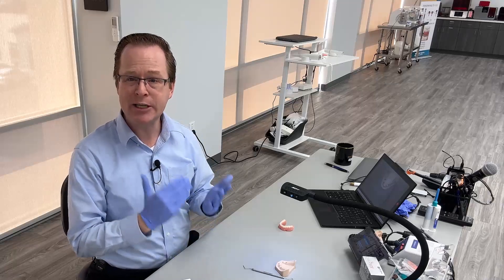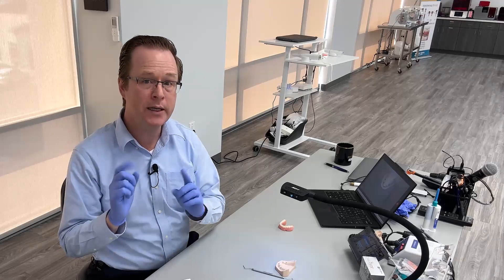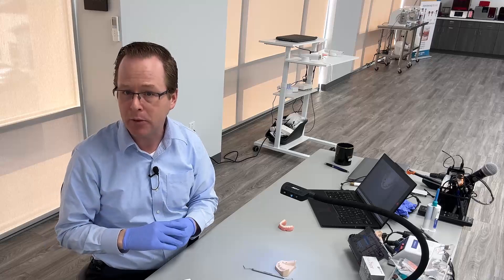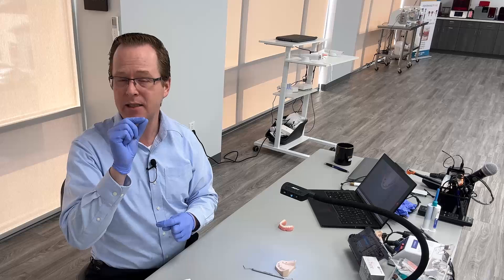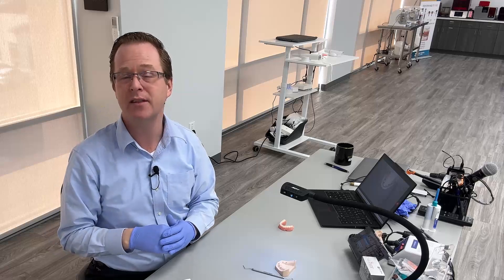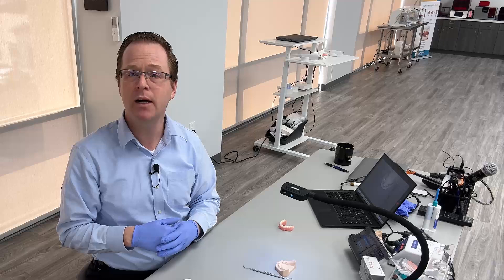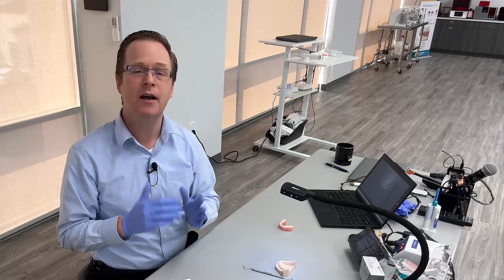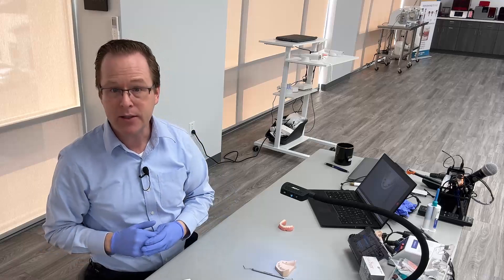Now, since I'm using an internal hex 3.5 millimeter connection, these come in half-millimeter increments. Some other implant systems for traditional locator abutments come in solid one-millimeter increments. As a guide, if my soft tissue depth is slightly taller than that two, three, 2.5, or 3.5 millimeter measurement, it's generally a good idea to err on the side of slightly taller for my locator and locator angled abutments. Let's move on to our distally placed implants to show how we apply that core technique to locator angled.